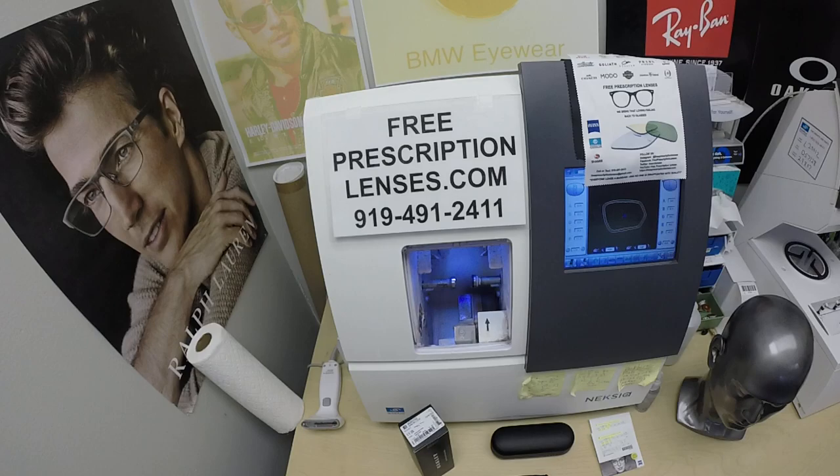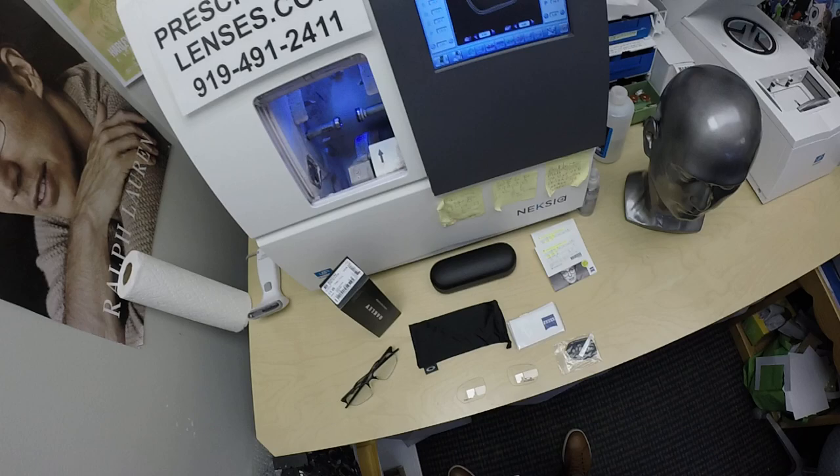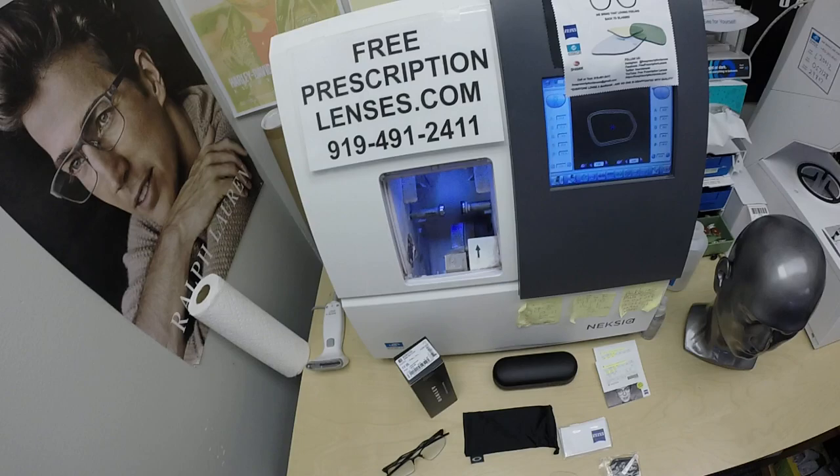Hello everyone, a special thank you to Danny in Harriman, Utah. This is freeprescriptionlenses.com, where everyone loves a bargain and no one is disappointed with quality. I am, in my mind, the hardest working optician in the industry.